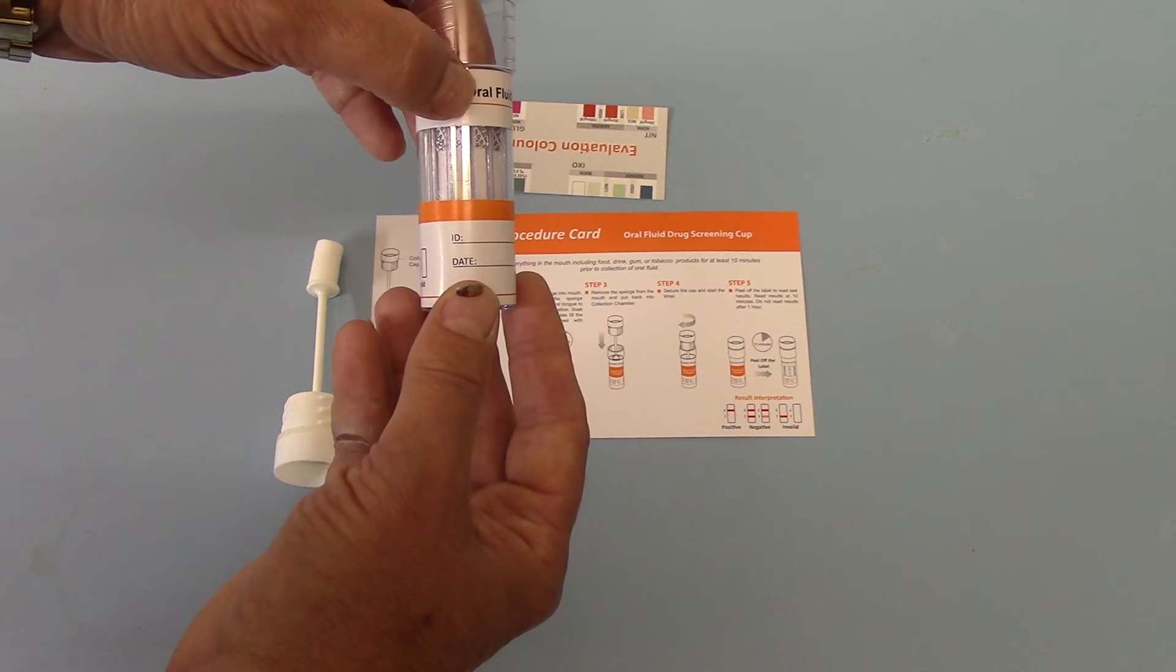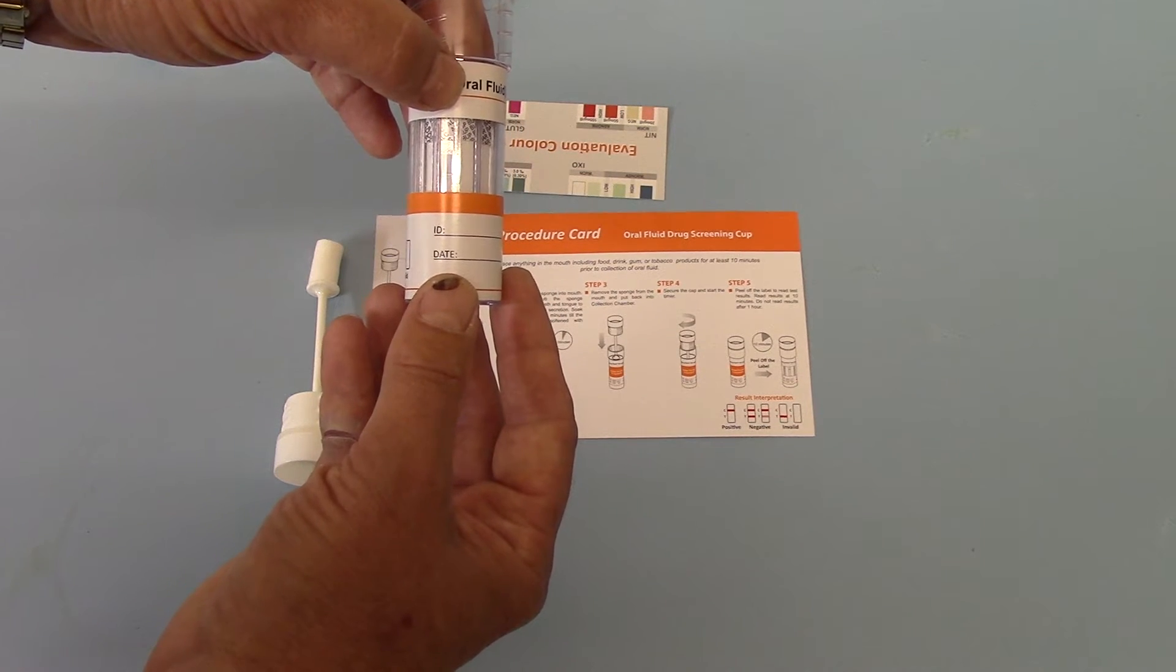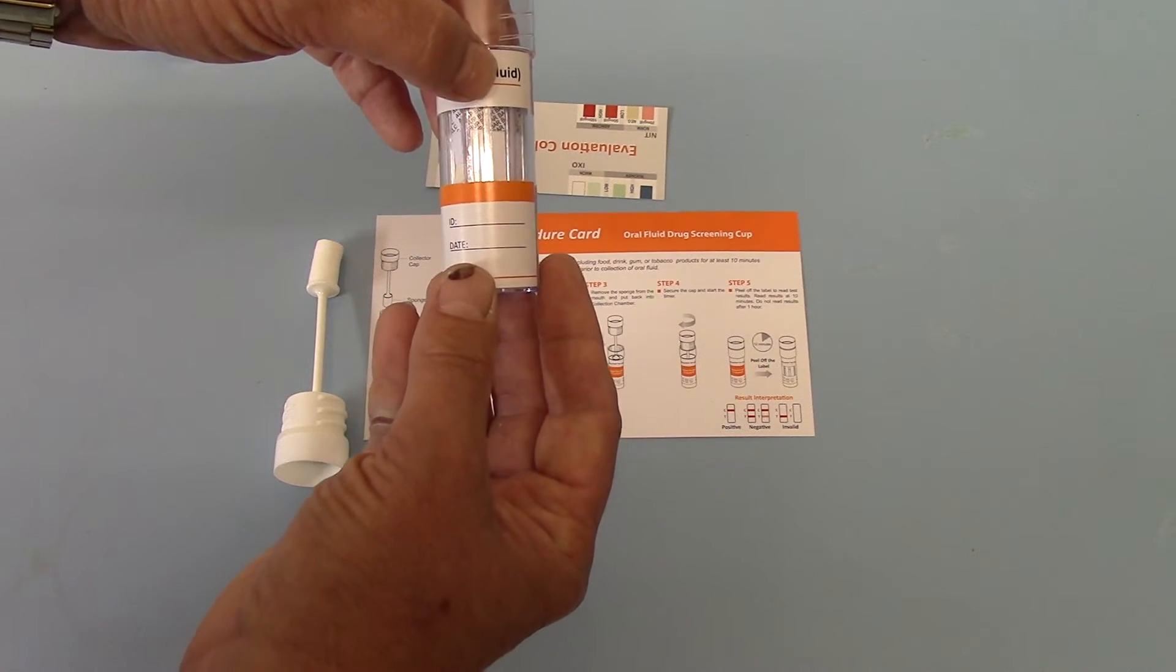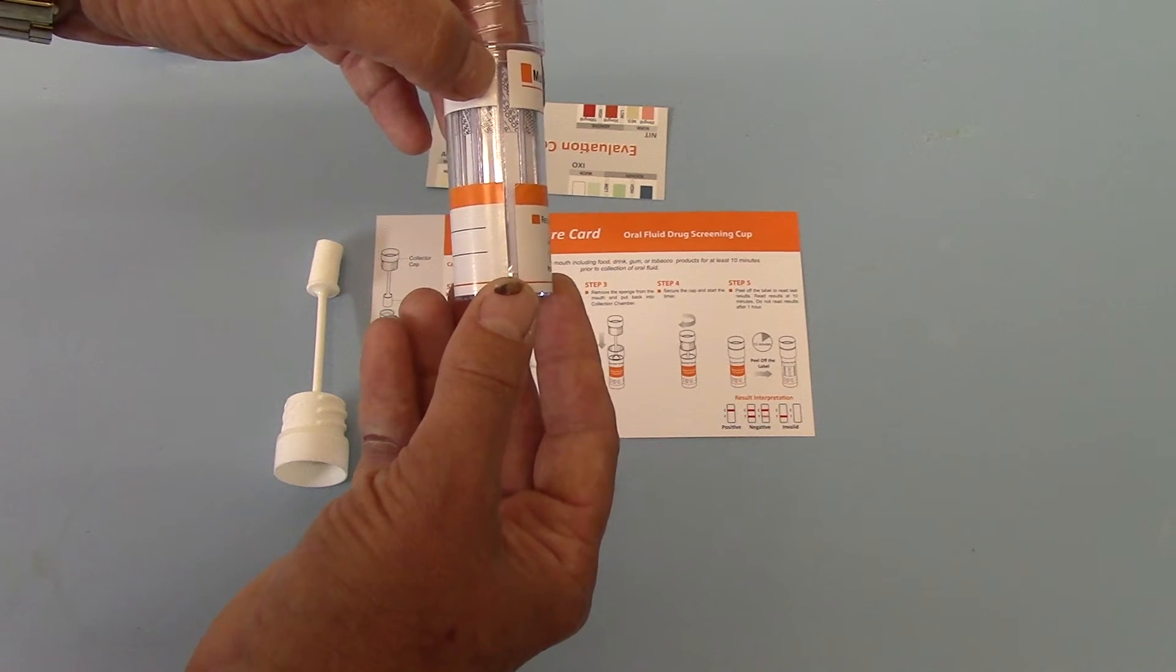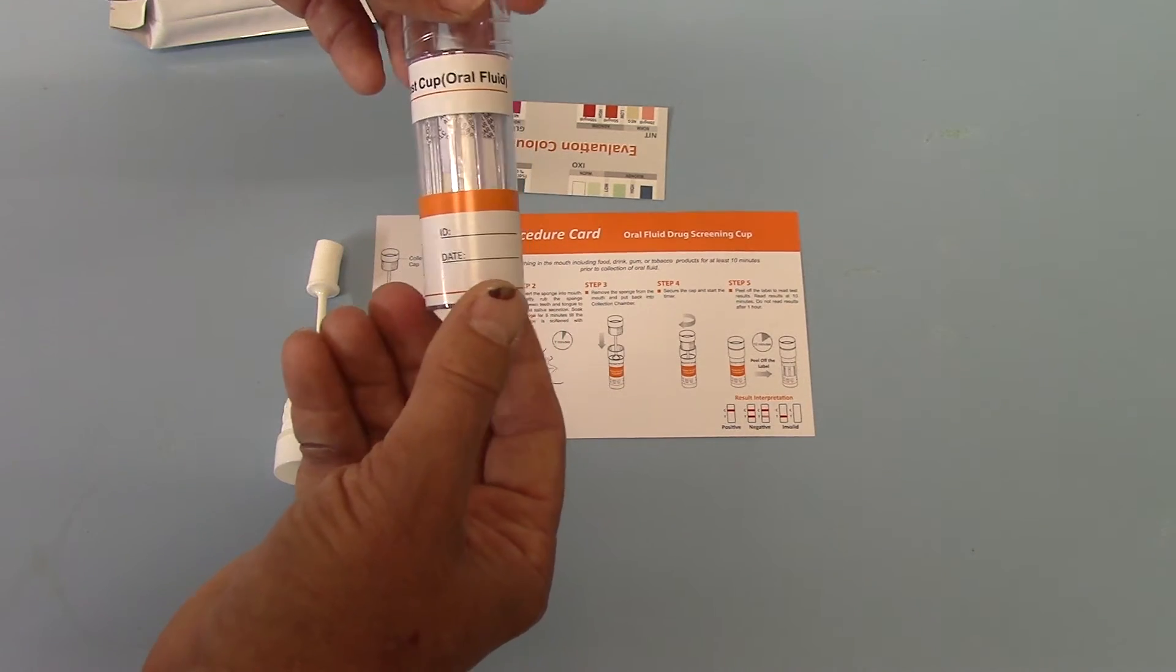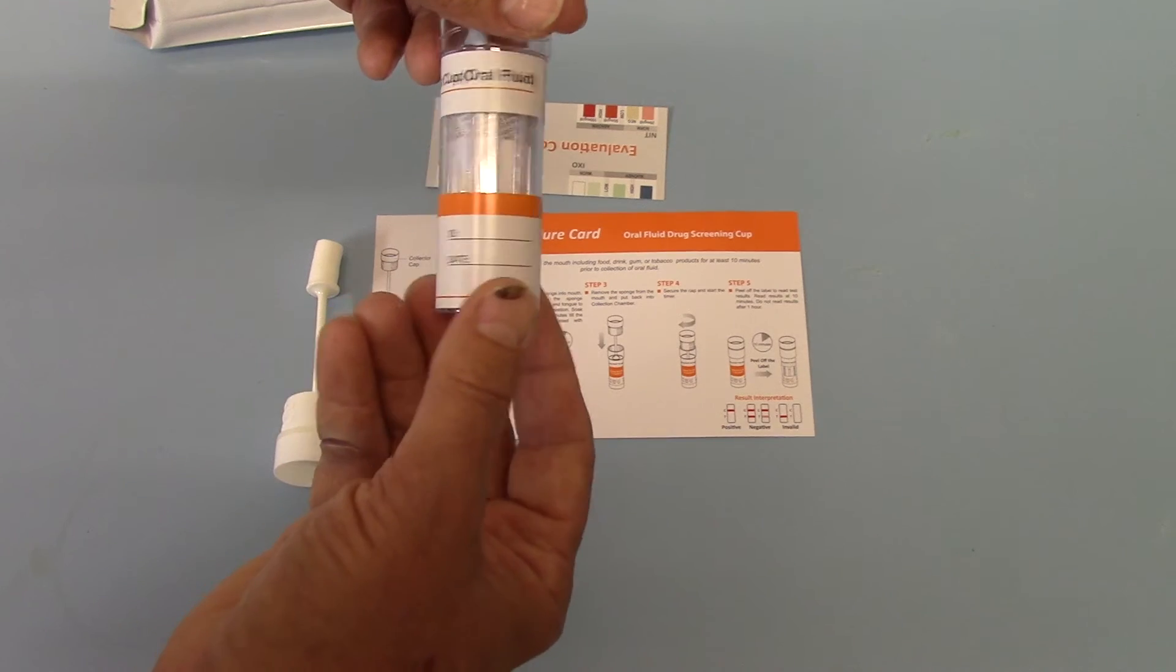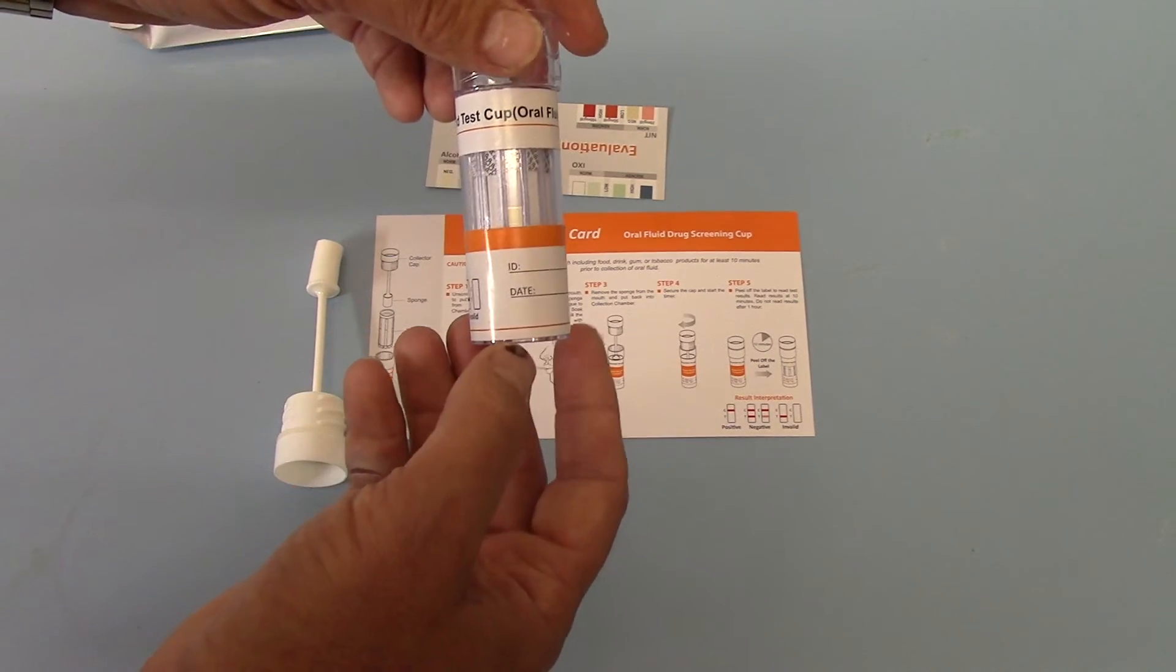PCP, ALC for alcohol, BUP for buprenorphine, BAR for barbiturates, MET for methamphetamine. So, around the circumference are your 11 drugs and one alcohol test.